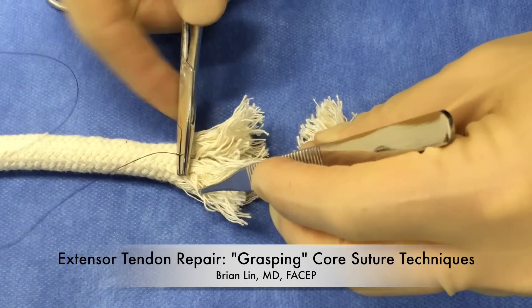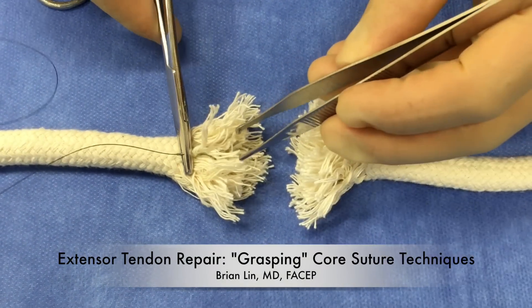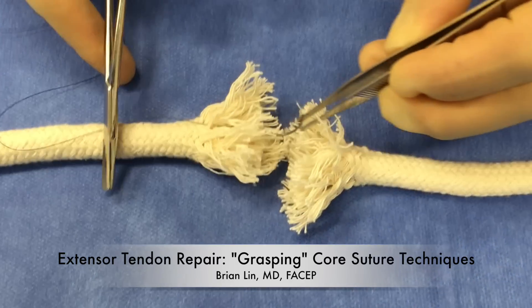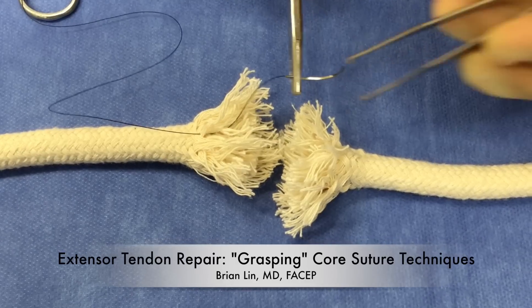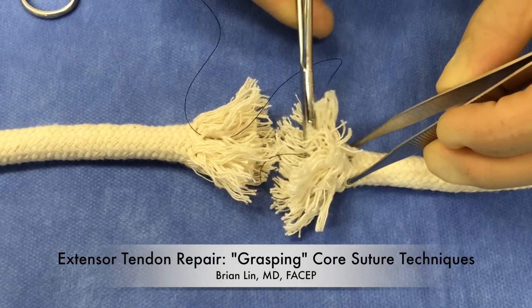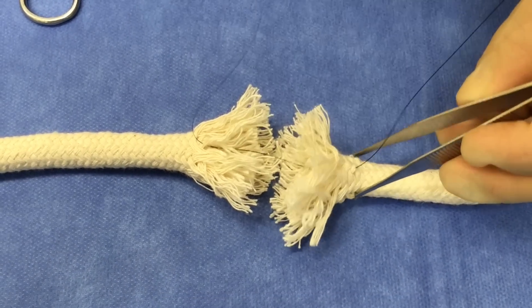Hi everybody, Brian Lynn here for lacerationrepair.com. In this video, I'm going to demonstrate using this model some techniques for extensor tendon repair which can be used in the emergency department. Specifically, I'm going to talk about some grasping core suture techniques.